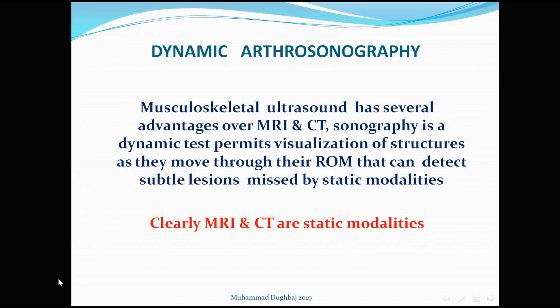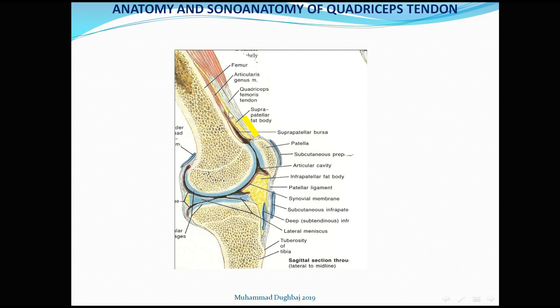Musculoskeletal ultrasound has advantages over MRI and CT because it is a dynamic test that permits visualization of structures as they move through the range of motion, and can detect subtle lesions missed by static modalities. MRI and CT are static modalities. Here is the extensor mechanism, which is composed of the quadriceps tendon including the patella and the patellar tendon, and this is the position of our probe during examination in long sagittal section.